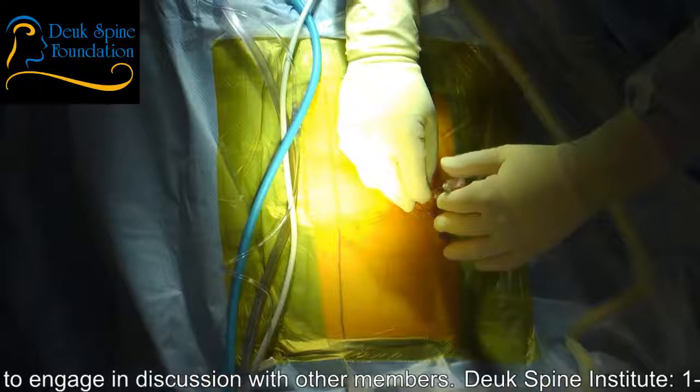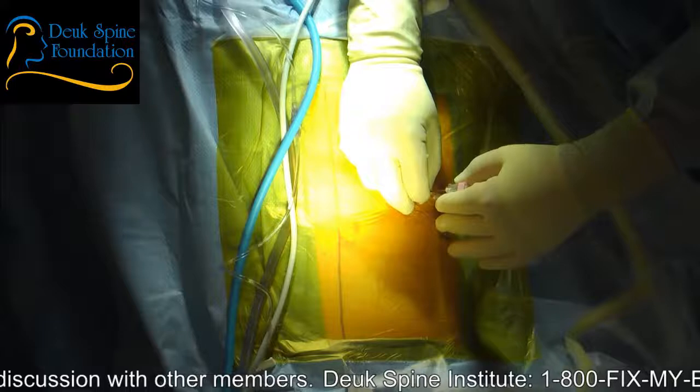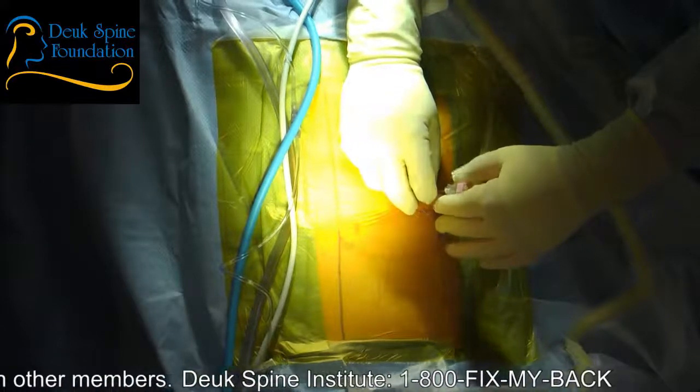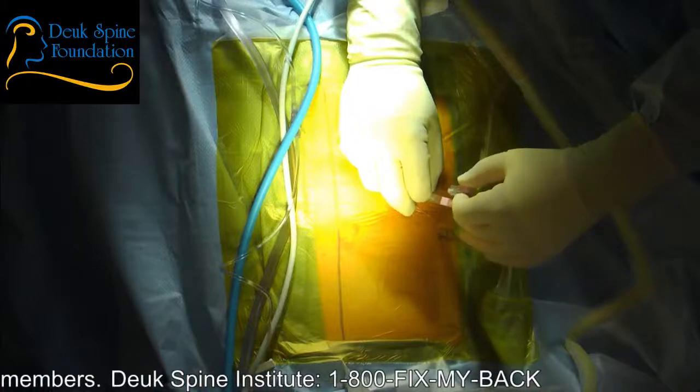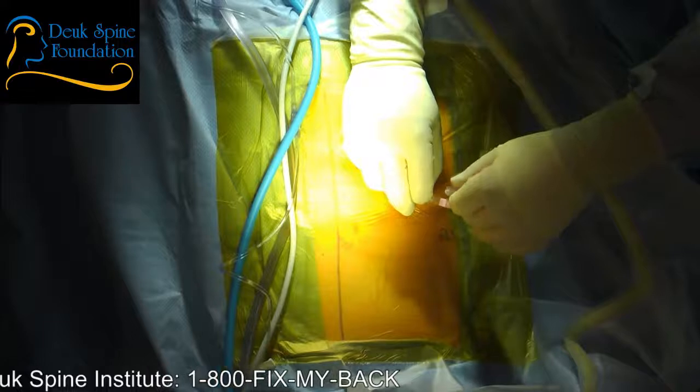I feel a lot better about this trajectory here. And I'm feeling that same problem, the herniation once again, but this is a better trajectory. The problem is she's so collapsed.